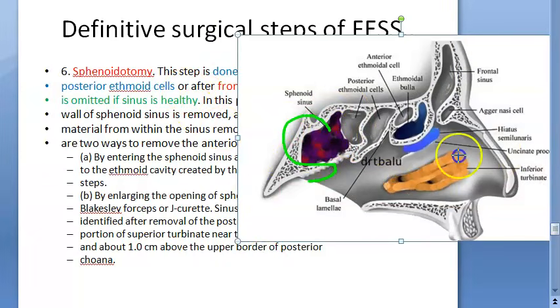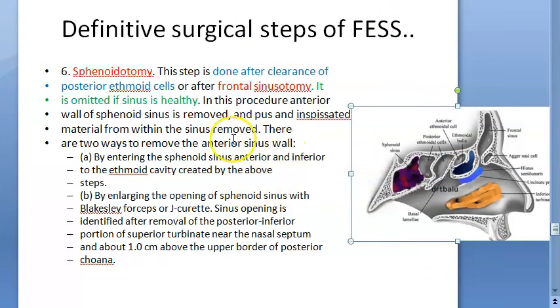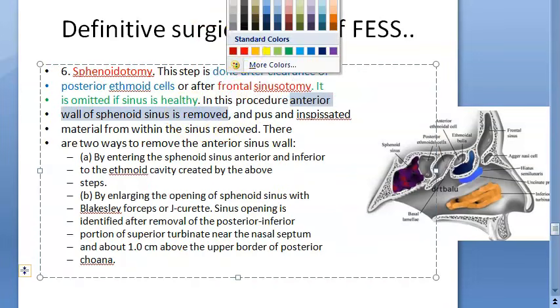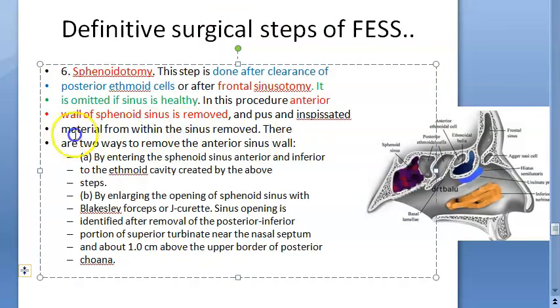So they are going to the sphenoid sinus. This looks like a Stammberger procedure from anterior to posterior. Finally, they reach the sphenoid sinus. In case it needs any work, only then are they doing this sphenoidotomy. So they will remove the anterior wall. Okay, the anterior wall of the sphenoid is removed, first any inspissated material. If it's there, they are removing it.